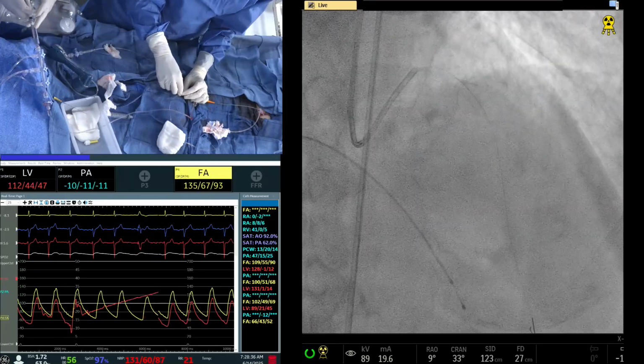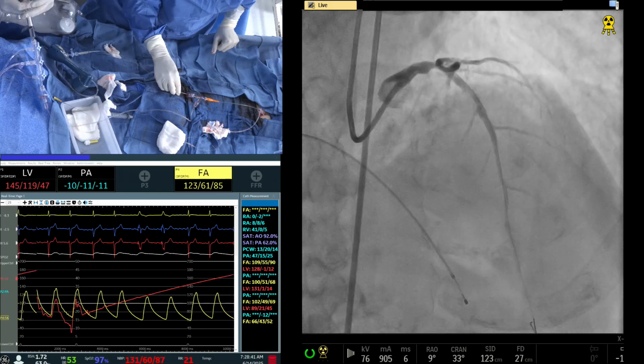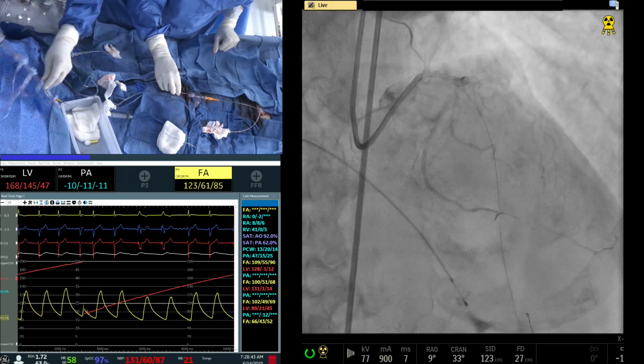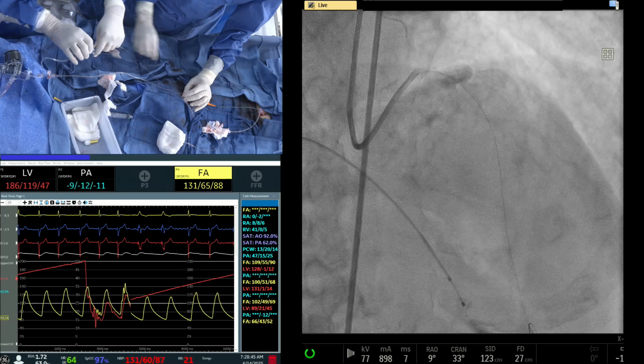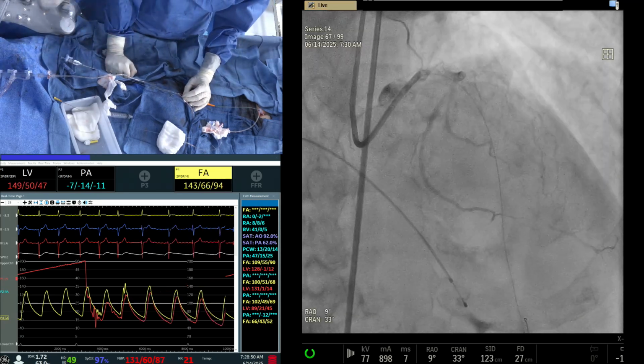Let me ask Dr. VVC Reddy and Dr. Roni, how do you proceed further? I think as Dr. Sharma is planning, a stent there distally first, then prepare more of the proximal with probably a cutting balloon, and that's the strategy. Just do the shot there then.